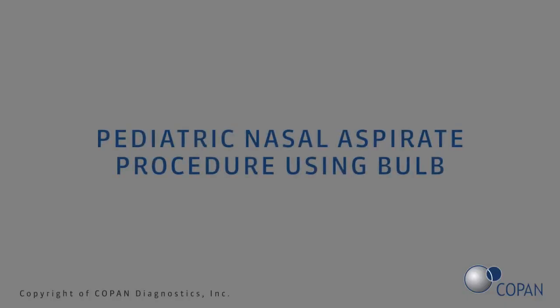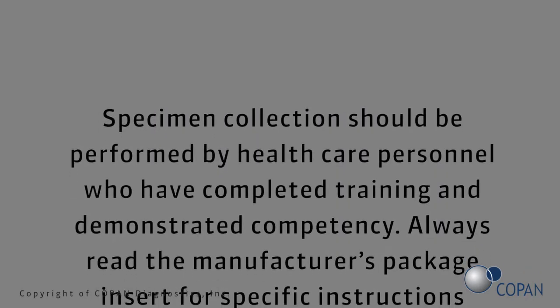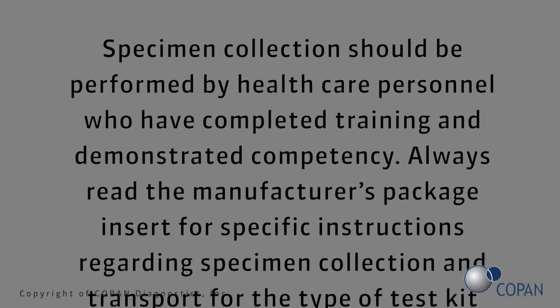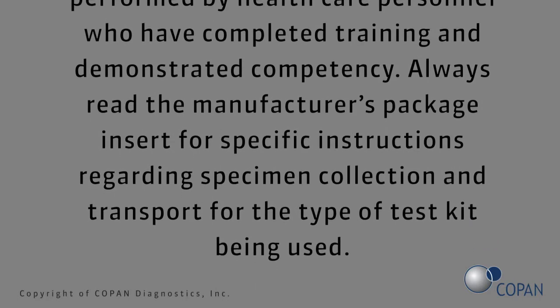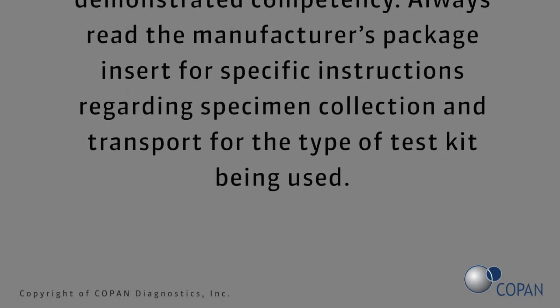Pediatric nasal aspirate procedure using bulb. Specimen collection should be performed by health care personnel who have completed training and demonstrated competency. Always read the manufacturer's package insert for specific instructions regarding specimen collection and transport for the type of test kit being used.